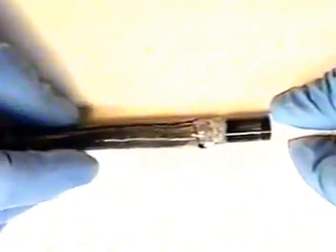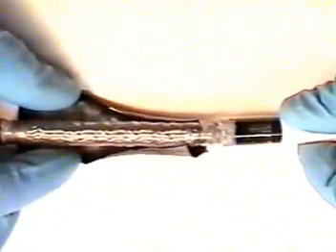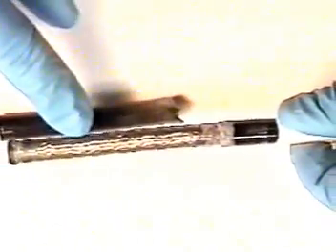Once the glue has been completely filed down, we can remove the remainder of the bending rubber by using a good pair of sharp scissors. Insert the blunt end underneath the old bending rubber, which is to be replaced, carefully cutting away towards the distal end. We have carefully cut off the existing bending rubber, which now can be removed, exposing the bending section mesh underneath the bending rubber sheath.